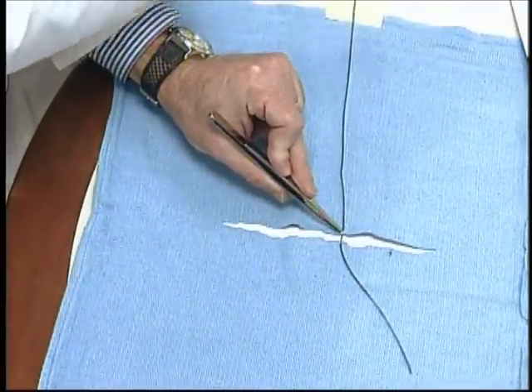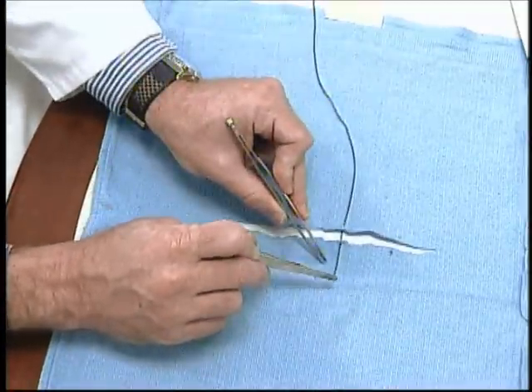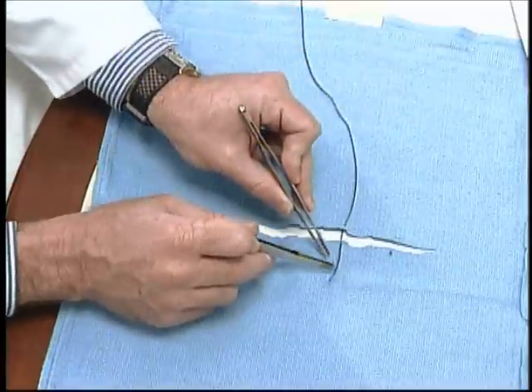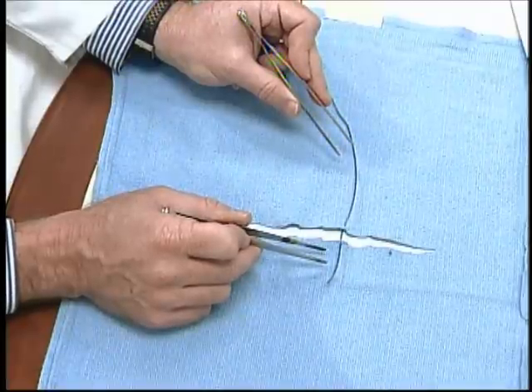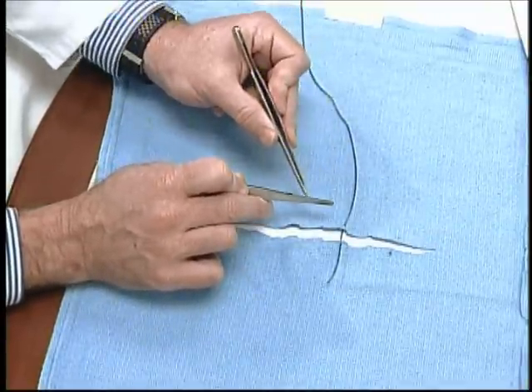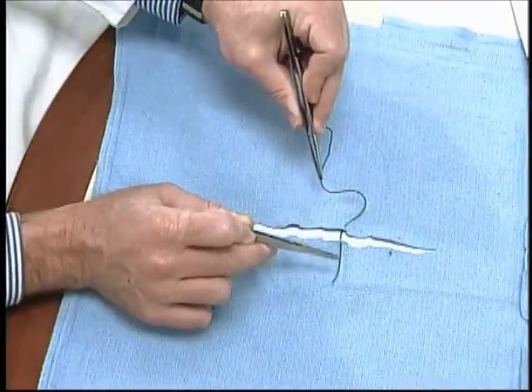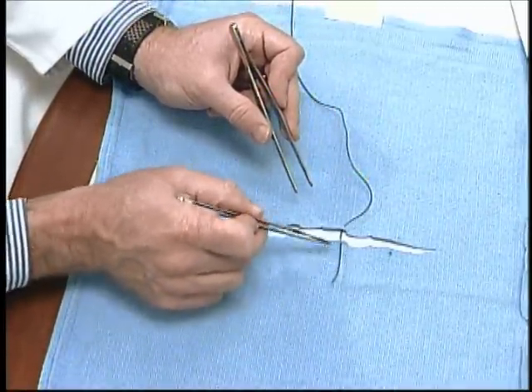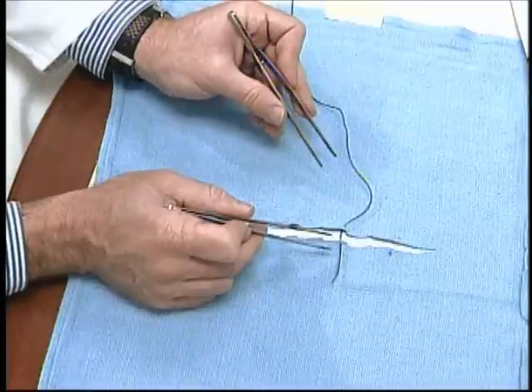When making the loop in microsurgery we don't want a big tail left behind because that will lead to entanglement. So we take it down until only a few millimeters of suture end are protruding. When making the loop, if you're using a jeweler's forceps the fine jaws can grasp the suture quite easily. However, if you are using a curved needle holder with larger jaws, this will cause difficulties picking up the end of the suture and an alternate technique is necessary for making the loop.